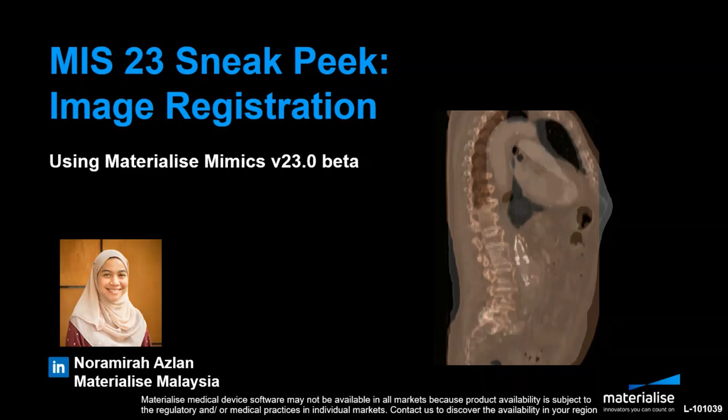Now registration is important in cases where multi-imaging modalities need to be combined, for example combining muscle from MRI scan and bone information from CT scans for your anatomical models, or for post-operative analysis to track and monitor changes at different points in time.